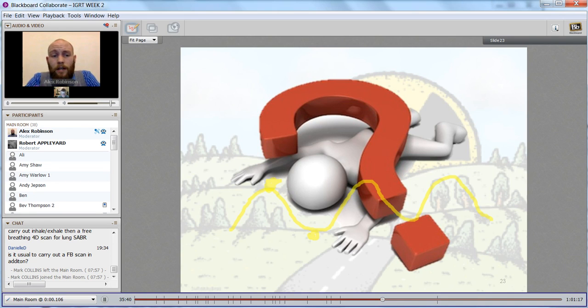And if there is a restriction, like there is on the Siemens scanner, of how long the X-ray tube can actually be irradiating for, it causes a reduction in scan length. And obviously, if we can't get a full volume of essentially our lung, then it makes it very difficult to plan from. Another thing that we have to consider is that because of the reduction, we've got an increase in dose and an increase in data.